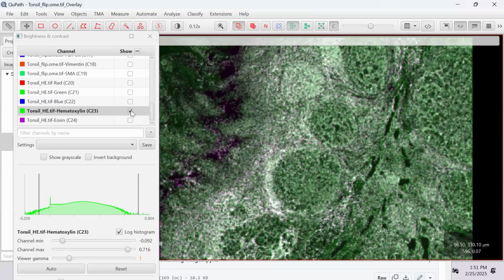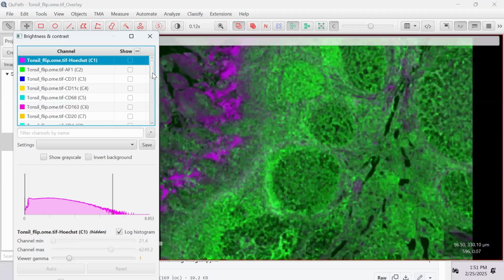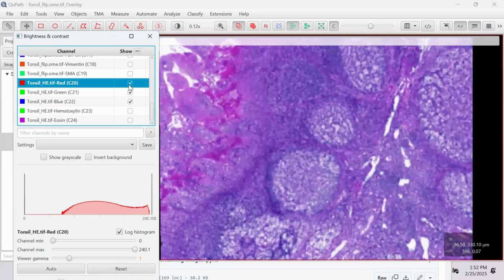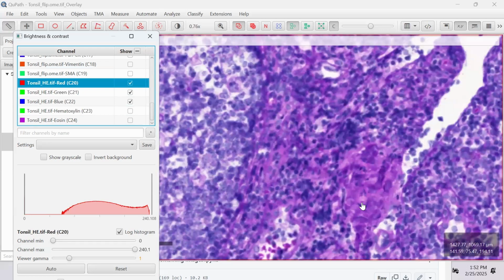Or you just want to take advantage of all of the knowledge that's out in the field, and you want to talk to pathologists, and you will show them your immunofluorescence image, and they will be like, sorry, what is that? Show me a good H&E, and I can tell you what this is.